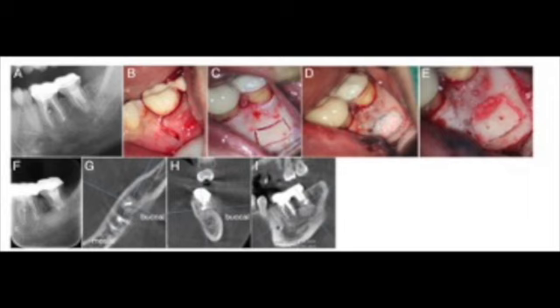After finishing the procedure and cleaning the surgical field, that bony block was repositioned at its original site. In 3 of those surgeries, bone graft of Bio-Oss was placed in the bony defect with a membrane, and they were tightly wedged between the bony block and the window border, and that grafting material provided support and stability to the bony block. While in the 7 other cases, the inward beveled edge of the bony block facilitated its replacement to its original position without the need to stabilize it.